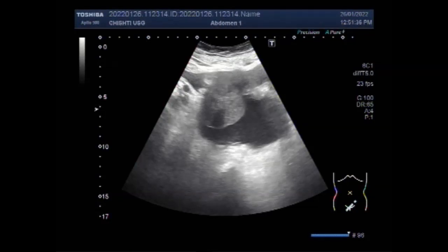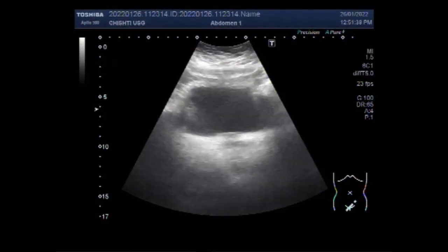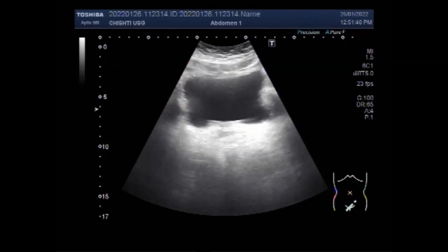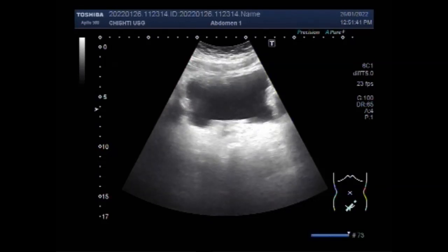Dear viewers, I hope you are all fine. This ultrasound video shows an ovarian mass in a patient aged about 70 years.